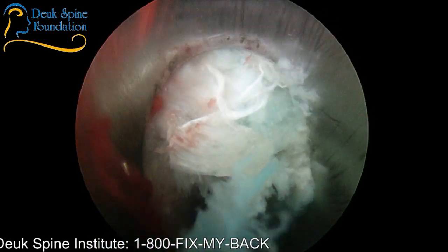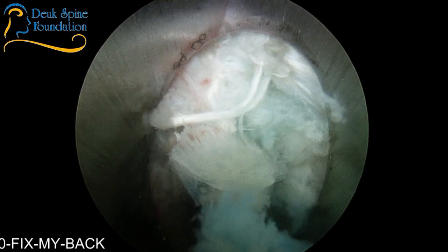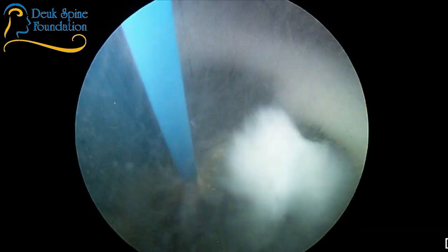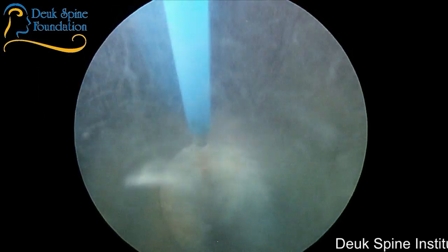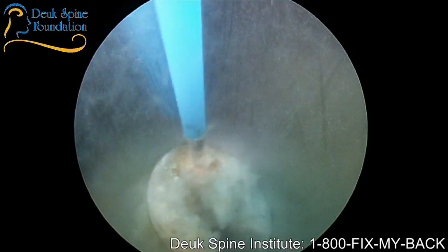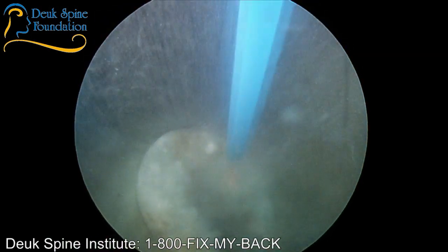All right, as we pull back, you can see how messed up this disc is. This is 100% not normal, and we know this disc was causing his pain. When I first looked at this patient's MRI, I saw that L4-5 and L5-S1 were the worst, and originally we talked about doing L4-5 and L5-S1. But once the patient came in and I examined him, I realized we were dealing with a problem at L3-4 as well. So we talked about doing all three discs instead of just two. And of course, this patient traveled from Canada to come here and have this surgery done.